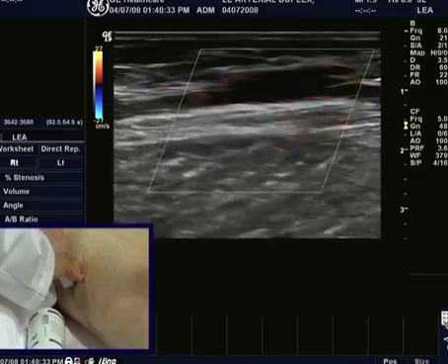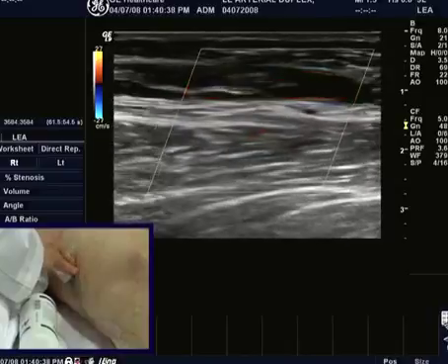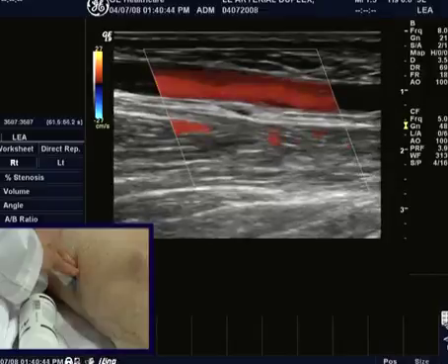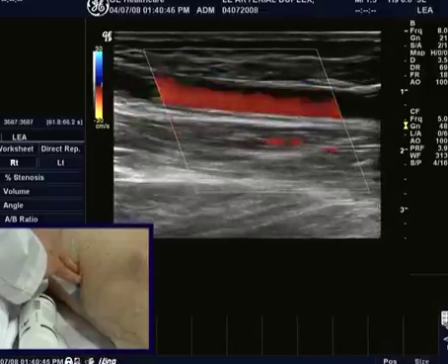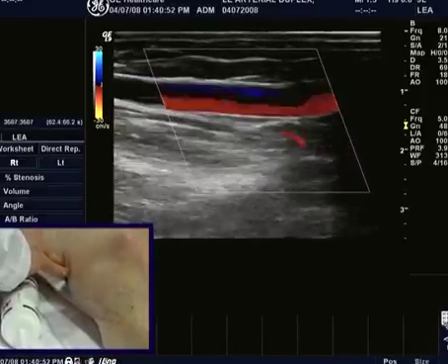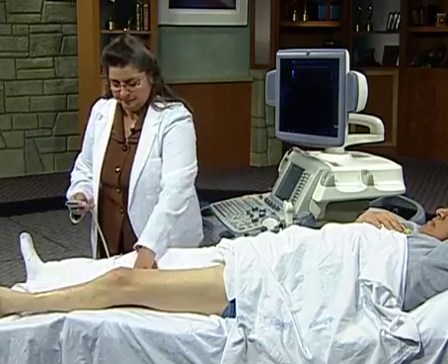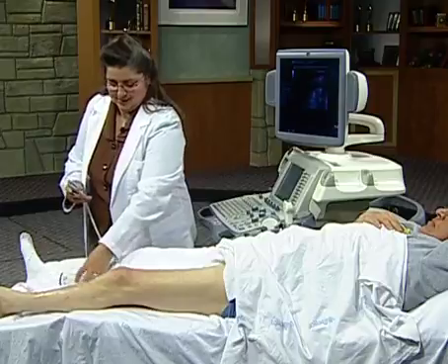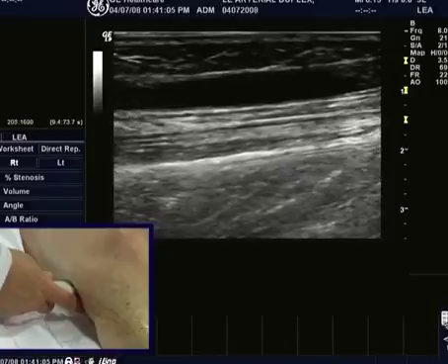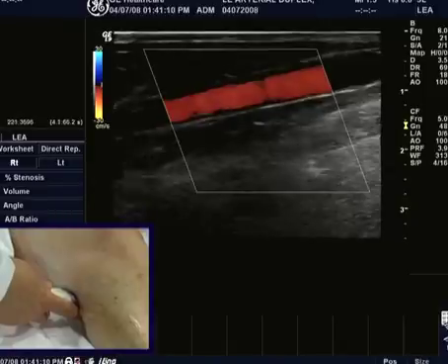And you can see you can actually do this pretty quickly, scanning down the bypass, because we're just not as worried about our angle. We can angle it, and now again a little back because the vessel is turning. And we're just continuing on down, down, down by his knee again. I'm just going to reposition my hand, get my gel bottle out of your way, so you can see how I am here. And again, this is very healthy looking conduit.